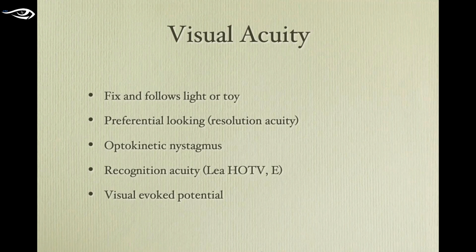The quantitative measure of visual acuity as an initial part of the examination on a young child, in my opinion, in a clinical examination, I'm not talking about a research exam, I'm not talking about an examination in a hospital setting. I'm talking about doing an examination in a clinical setting where the issue of time is great, where you have other patients waiting and you got to get through important aspects of the exam as quickly as possible. This is the way I do visual acuity testing. I want to see if there's a difference.